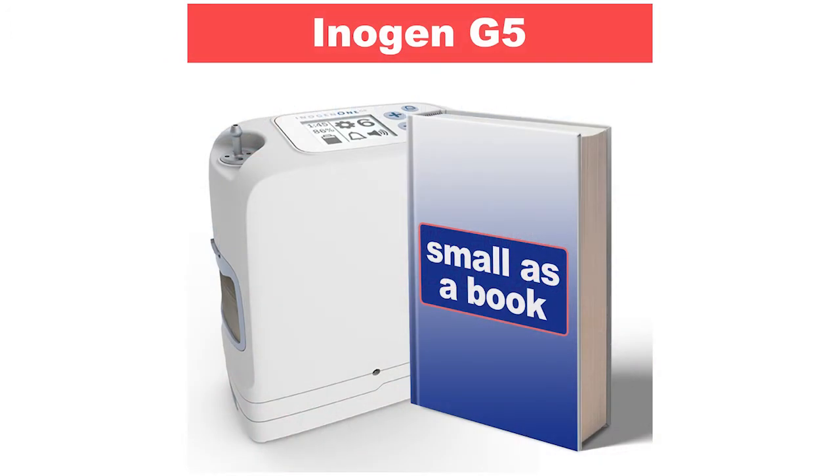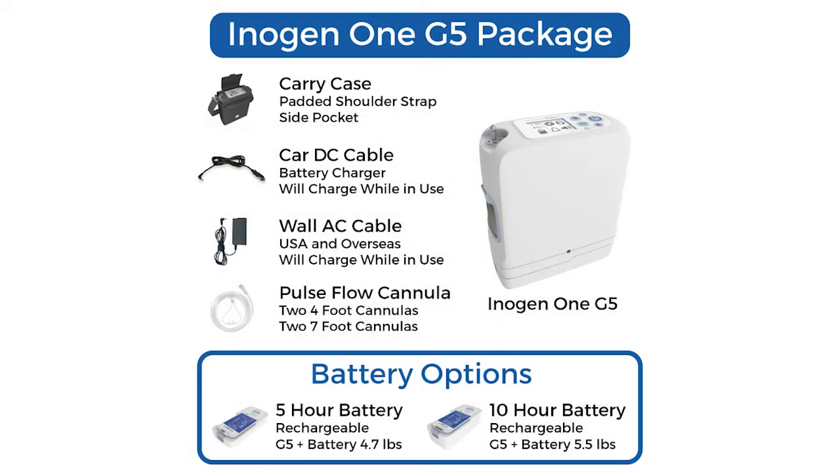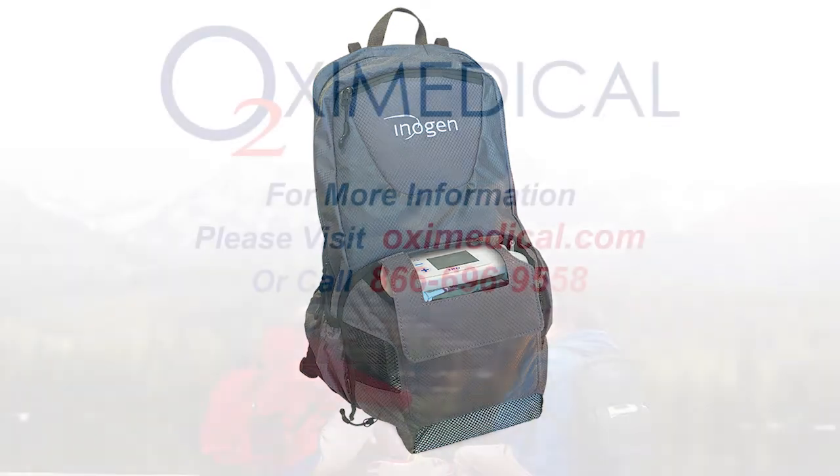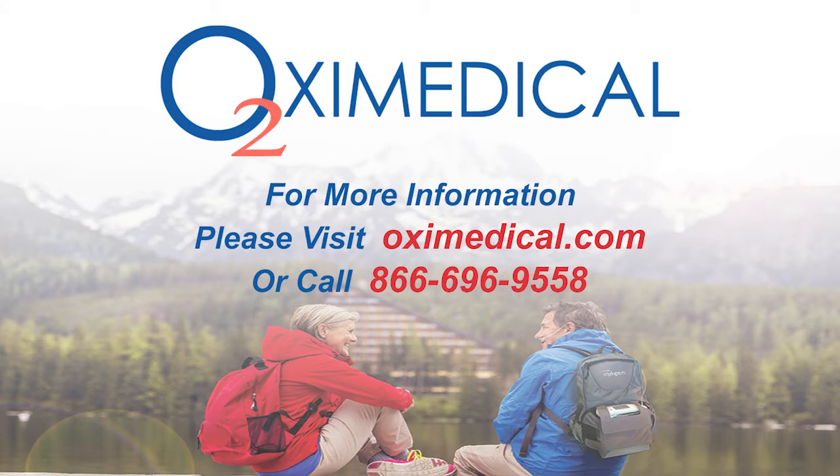Holding it in my hand, I comfortably have both hands on the sides of the machine. It weighs right around 4.8 pounds — slightly under 5 pounds — and that's with the small 5-hour battery, also known as the 8-cell. The basic package includes a house charger, car charger, and a carry case with a shoulder strap you can wear across your shoulder or across your body. Backpacks are also available, so you can go hands-free and equally distribute the weight, and carry multiple things at once.